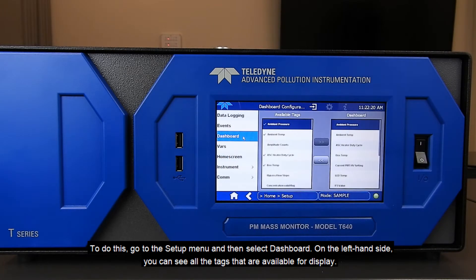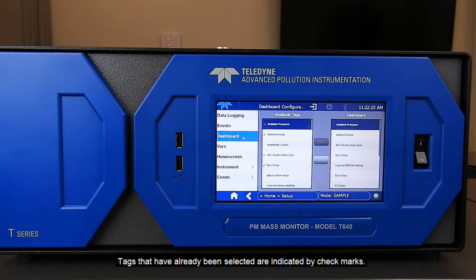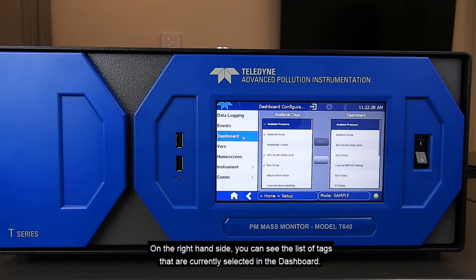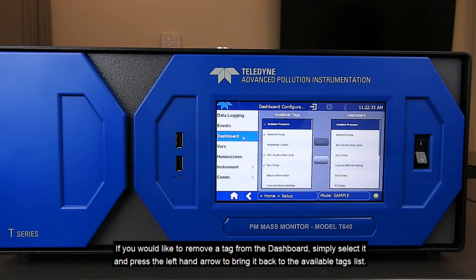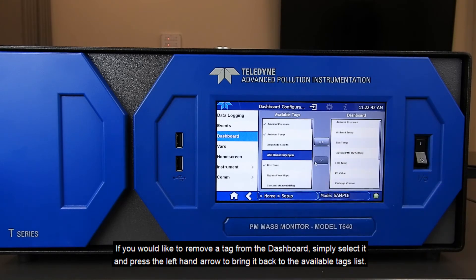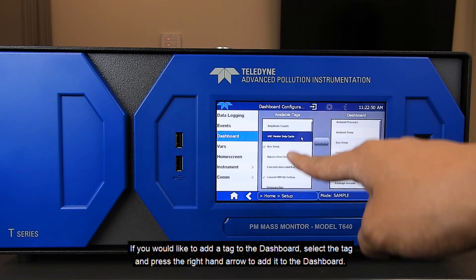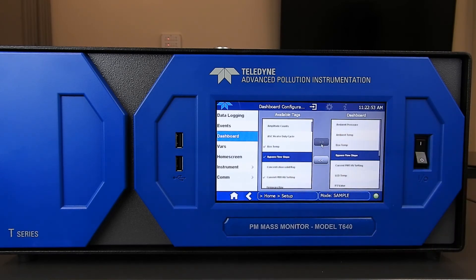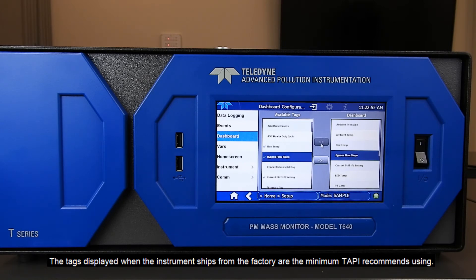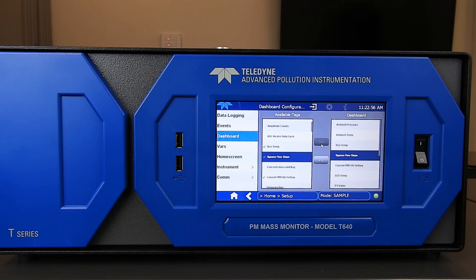On the left-hand side, you can see all the tags that are available for display. Tags that have already been selected are indicated by check marks. On the right-hand side, you can see the list of tags that are currently selected for your dashboard. If you would like to remove a tag from the dashboard, simply select it and press the left-hand arrow to bring it back to the available tags list. If you would like to add a tag to the dashboard, select the tag and press the right-hand arrow to add it to the dashboard. The tags displayed on the dashboard when the instrument ships new from the factory are the minimum that Teledyne API recommends using, but please keep in mind that you can select any tags you would like to display, or whatever is meaningful to you.